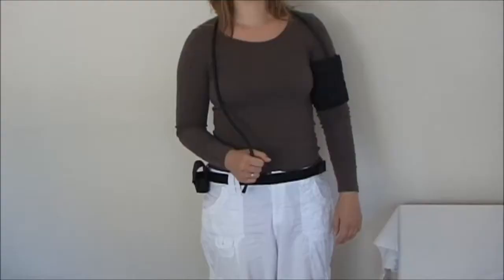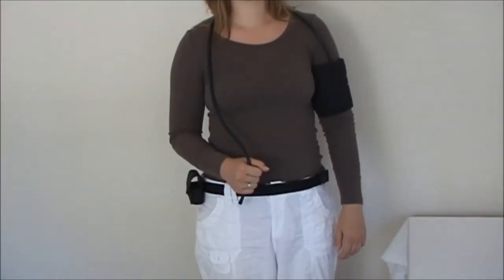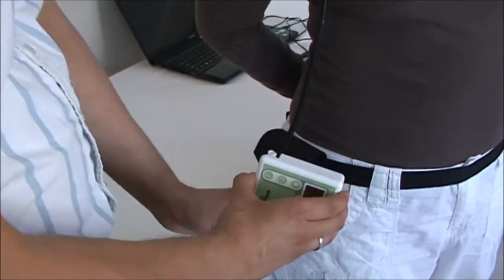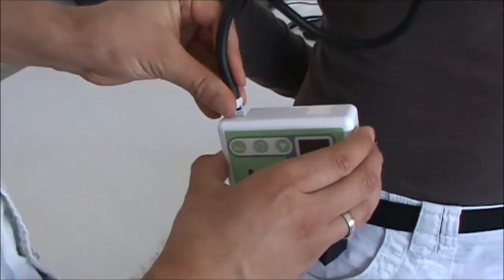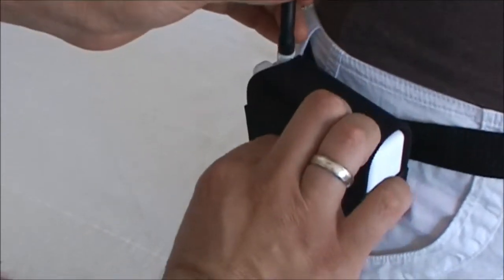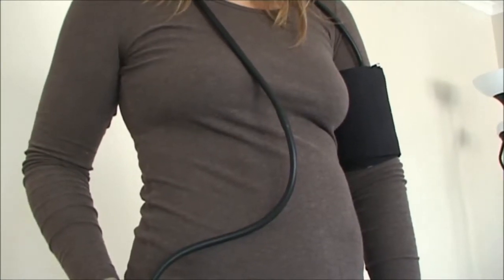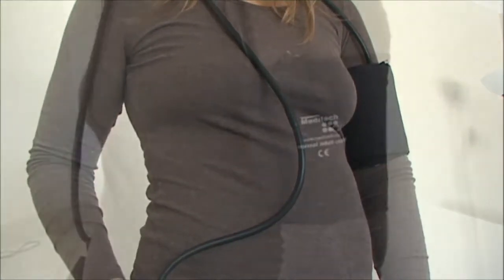With an overly loose cuff, the recorder must pump a lot more to tighten the cuff, which causes considerable discomfort for the patient. The next step is connecting the cuff to the device and inserting the device into the pouch in a way that the buttons are facing outward.